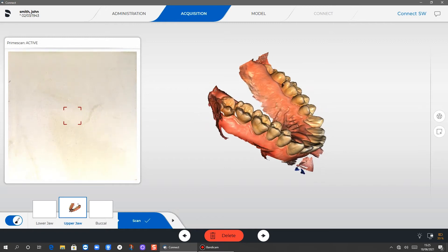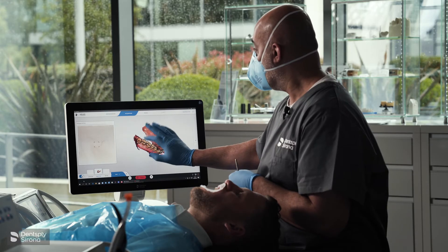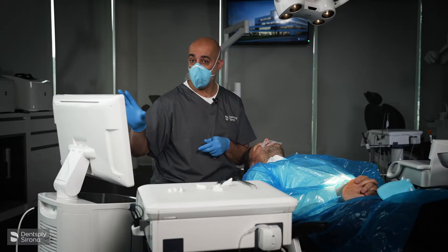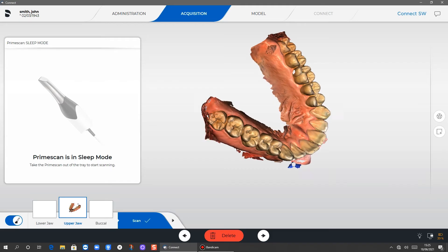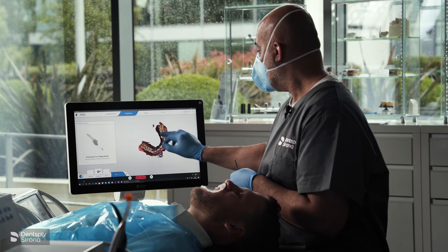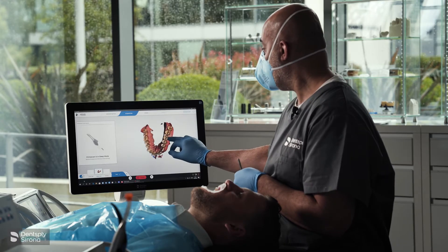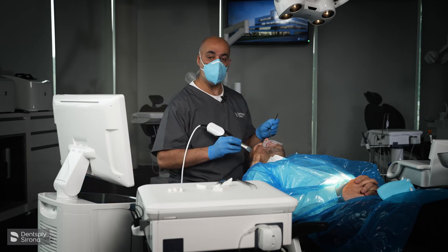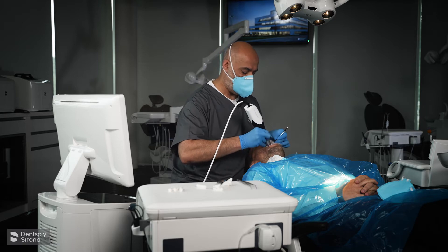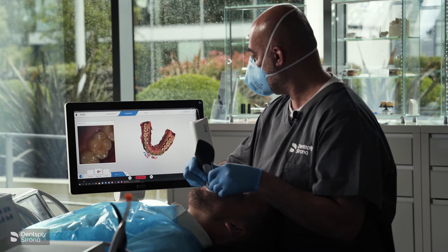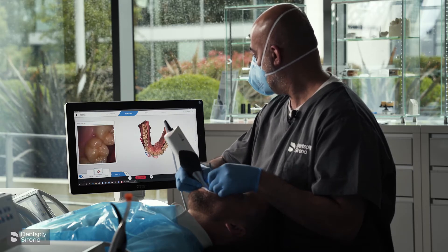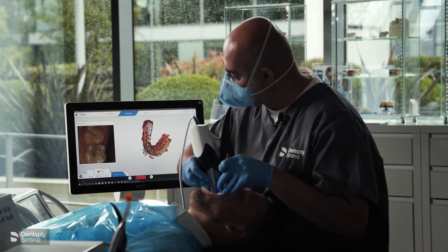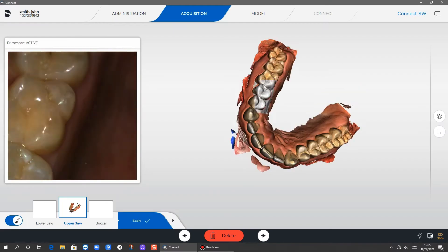We're just missing right at the disto-buccal of the seven and the interproximal, and we've got some soft tissue — this will be cropped in the model stage, so we don't need to do any editing now. We're missing a little bit of data on the disto-palatal cusp of the six, but otherwise we have a very clean scan. We'll go back in and collect those missing points. I want the disto-palatal of the six — pen grip again — rotate, and as soon as it starts to stitch, I've got that area. I'm going right to the areas I need, then going back in to get the buccal of that eight. Fantastic.